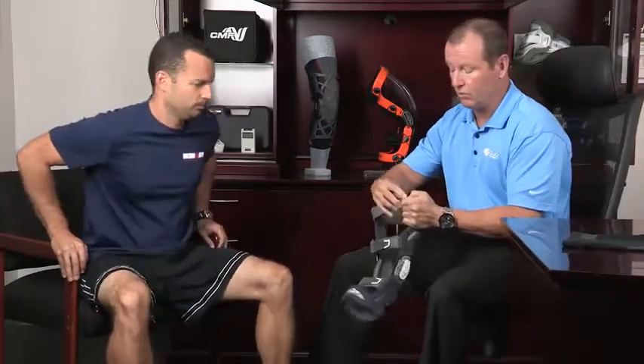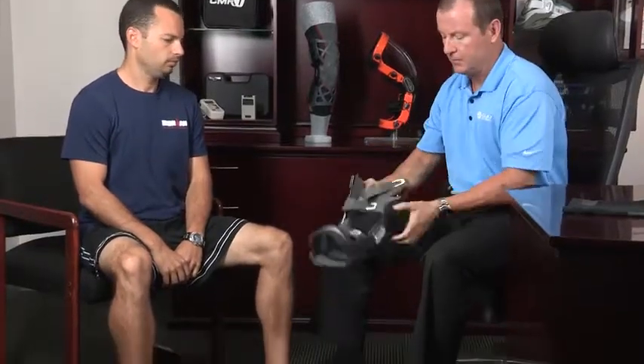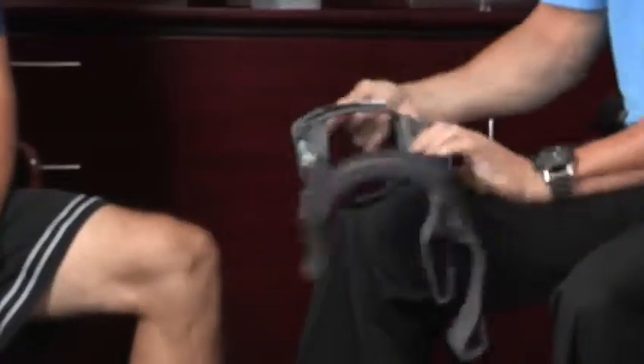One thing you want to know — there's a lot of Velcro here, so what may help you when you're taking your brace off is you put the straps back like this on themselves, kind of back here a little bit, and that way all the Velcro is out of the way.